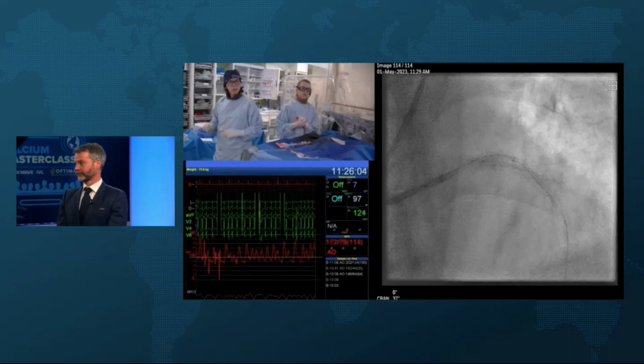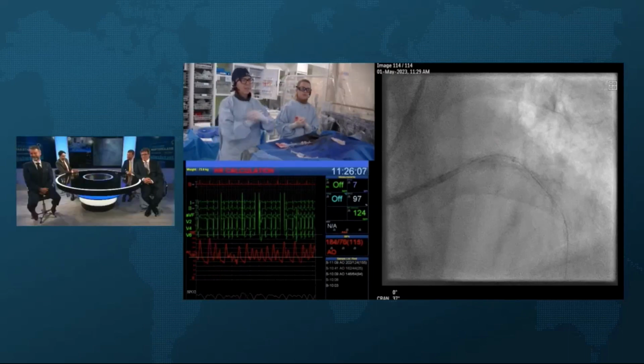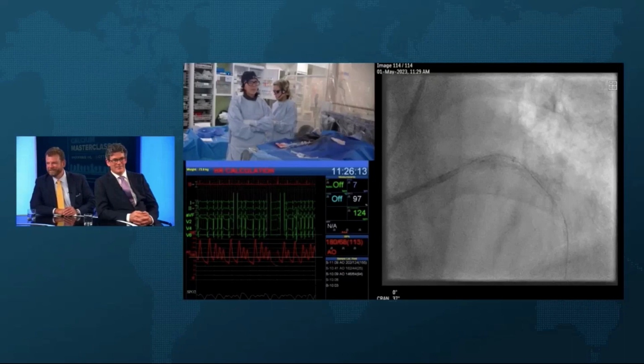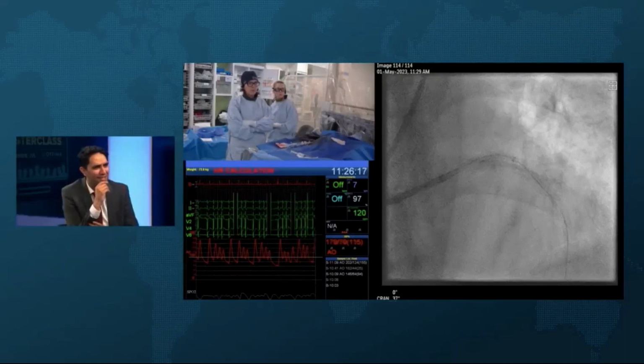I only know because I've done it myself many times. Run the IVUS back and forth. Just sort of look up at the ceiling like, why? Because we use so much device detection. I swear I put more left main stent in there. Oh, that's why.